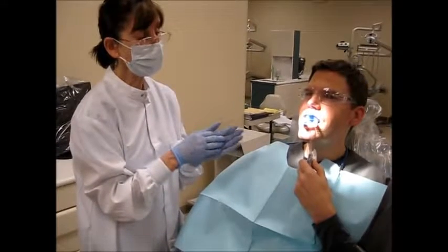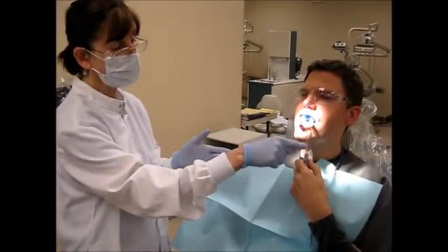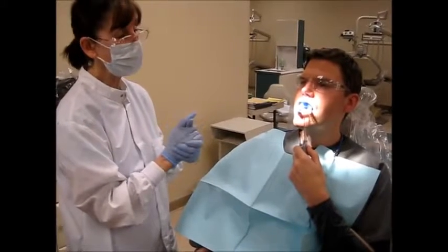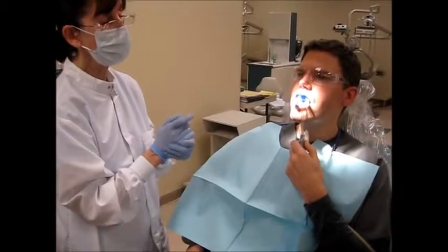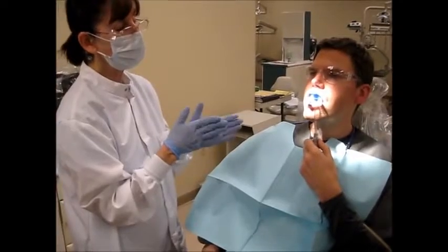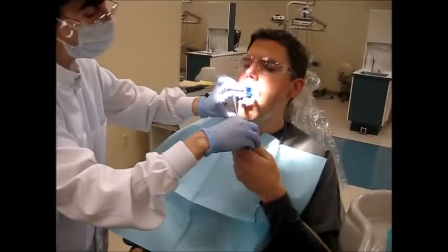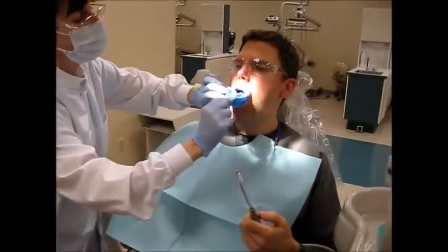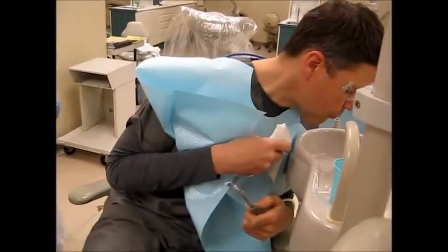As I'm approaching the end of that 4 minutes, I'm going to remind the patient that I'm going to take the tray and the rolls out and place them into biohazardous waste. I'm going to place the saliva ejector back onto the bracket arm, and I'm going to ask the patient to expectorate thoroughly into the cuspidor so as not to swallow any of that fluoride. So I'm going to let the patient know at this point in time that they're going to open wide. And you can just hang on to that saliva ejector if you want. I'm going to take the tray and the rolls, and I'm going to ask the patient to expectorate thoroughly in the cuspidor.